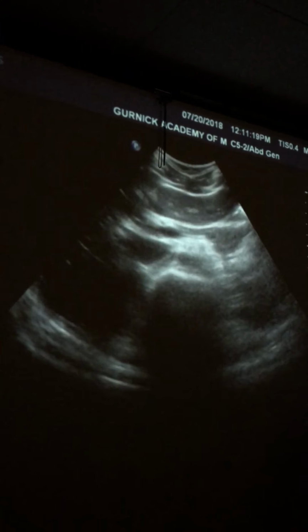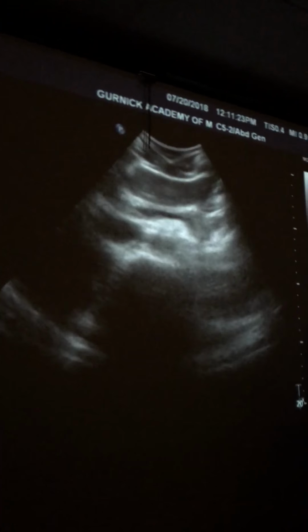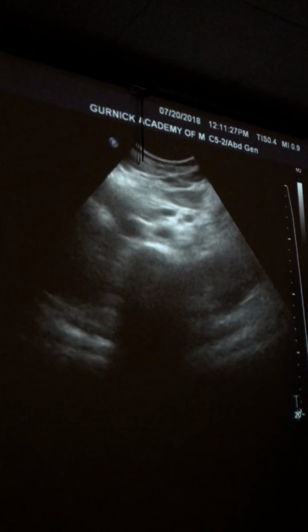So they're showing the left is not coming out of the IVC, going into the other side. You want it to be off the IVC, like show us that. So it's like taking a picture of the renal arteries on the aorta. It comes off both sides. So what's my landmark? Actually, I'll show you later. Renal artery, the other renal vein.